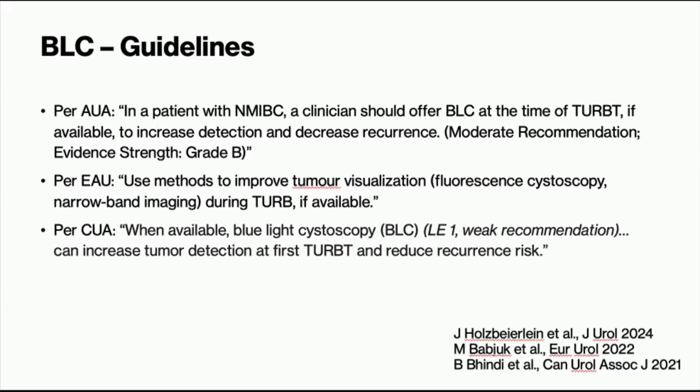So where do the guidelines stand? Well, AUA, EAU, and CUA all provide kind of moderate to weak recommendations, and they all state when available, you can use blue light cysto to increase detection and decrease recurrence. And we've kind of highlighted some of the evidence behind these guidelines. But you may notice there's something else, a bit of foreshadowing of the next topic. EAU also recommends something called narrowband imaging. So what's that?